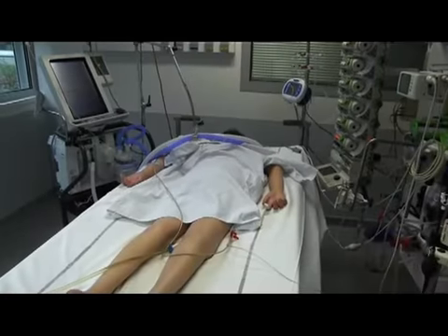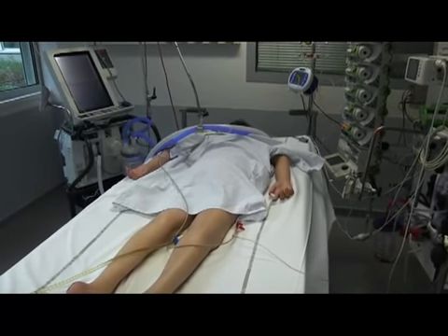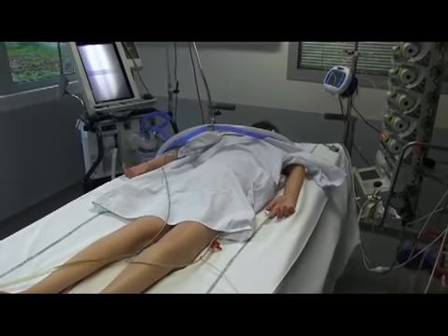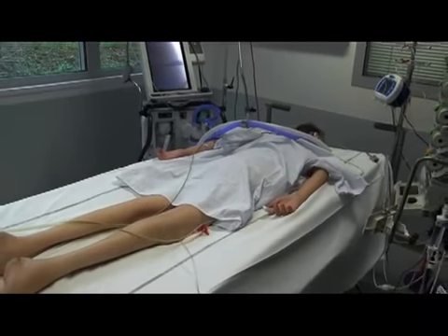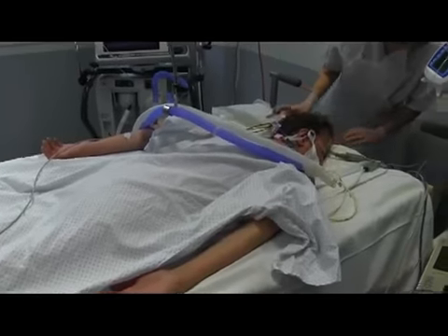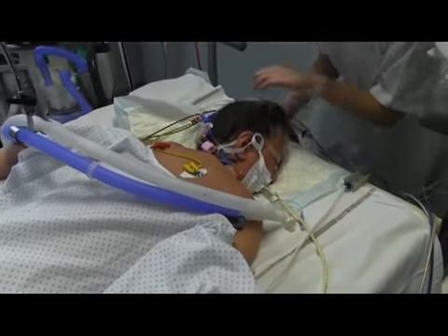The fifth step is post-proning installation. The patient is moved to the center of the bed. The head is turned laterally and repositioned every two hours. The endotracheal tube must be easily accessible. Care should be taken to close the eyelids tightly and avoid ear-kinking.